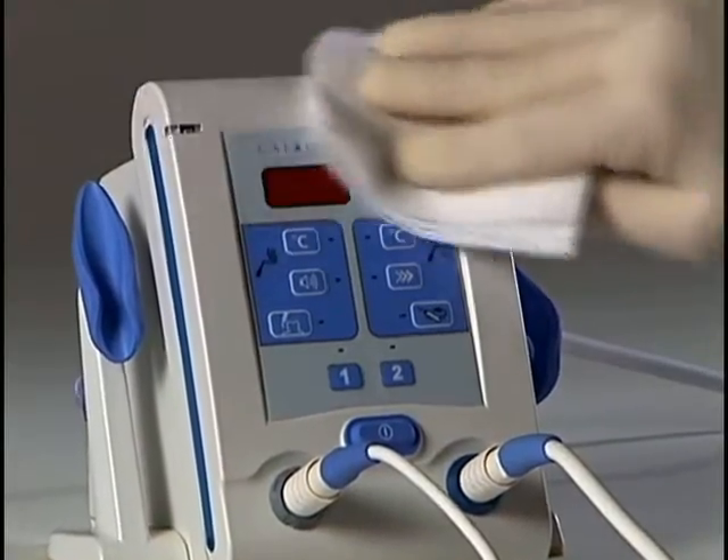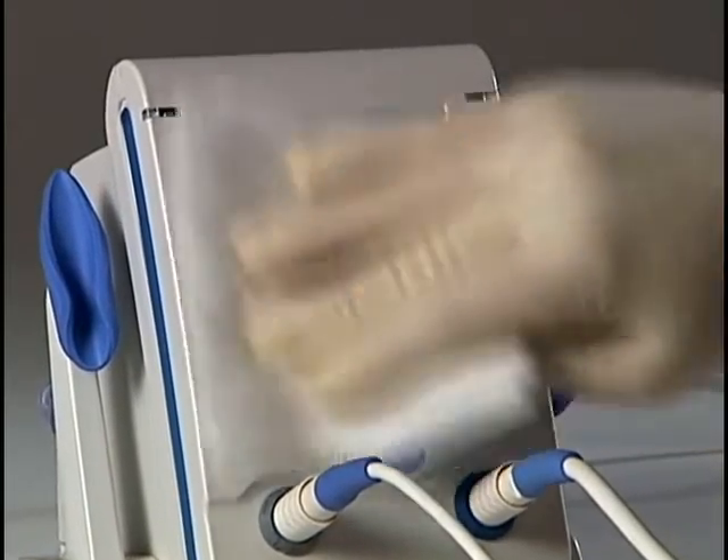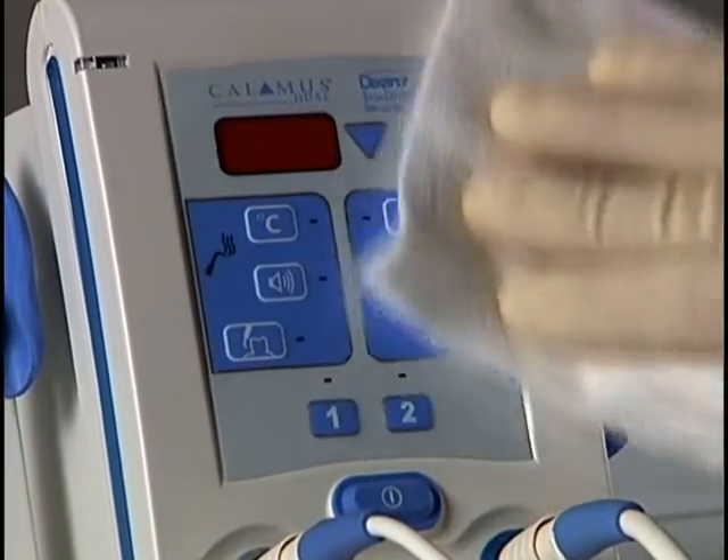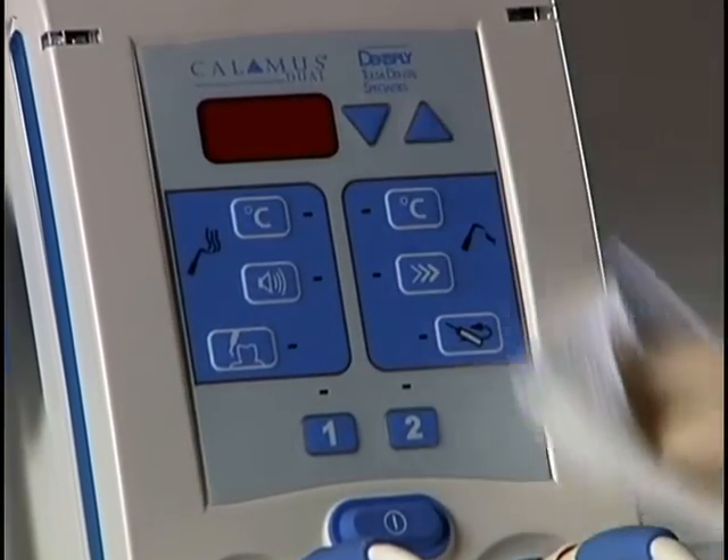The control unit should always be wiped down with a mild disinfecting solution. Do not use a chlorinated solution. Never submerge any part of your Calamus devices.